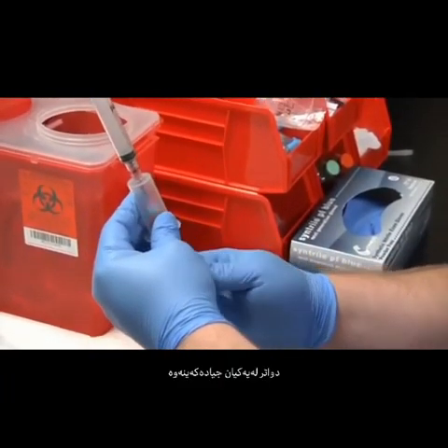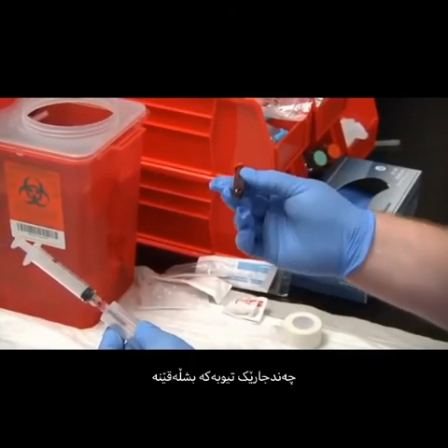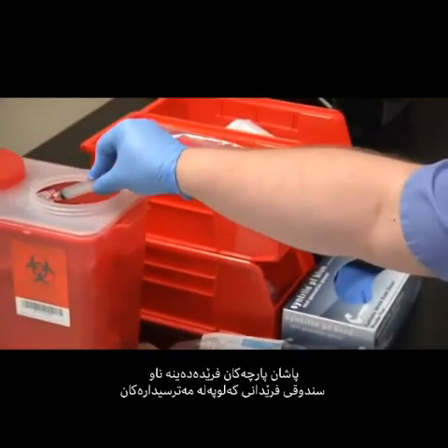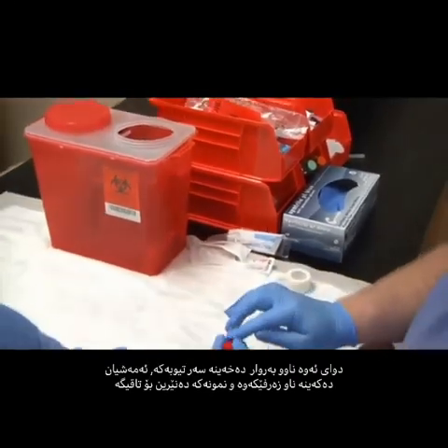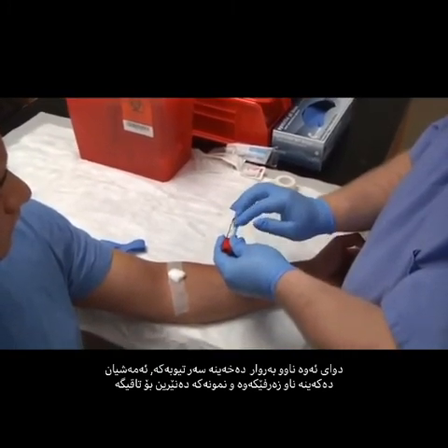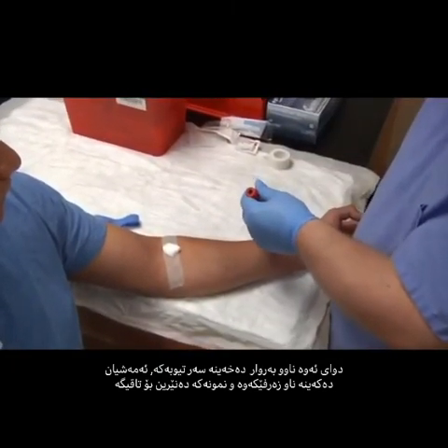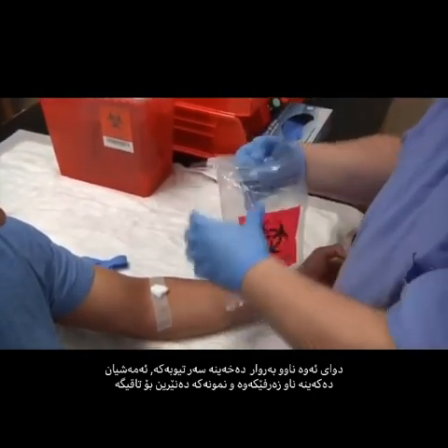Disengage your tube and invert three to four times. Discard the assembly into the biohazard box. Go ahead and put your patient's name on the label, the date, time, and your initials. Place into the biohazard bag and send your specimen to the lab.